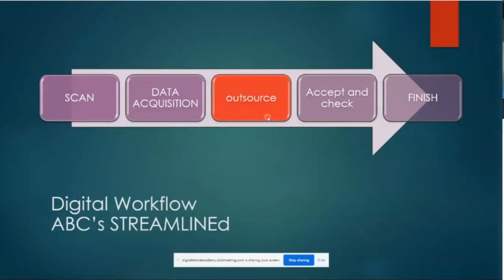I would say that here you can see the outsource in red. So you can do the scan, the data acquisition, and instead of the CAD, the CAM and even the manufacturing, you can outsource everything. After you have a correct data acquisition, you can start outsourcing your work. This way it's a very precise, predictable, and very efficient way of working with digital dentistry, because you will be delivering very high quality work to your patient, meanwhile you're learning what you're doing.